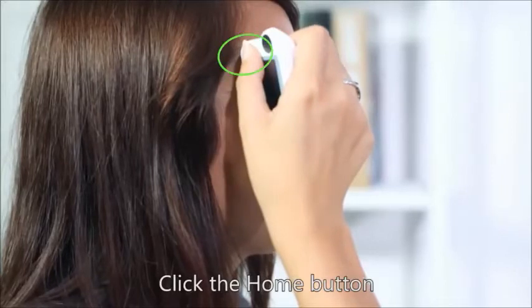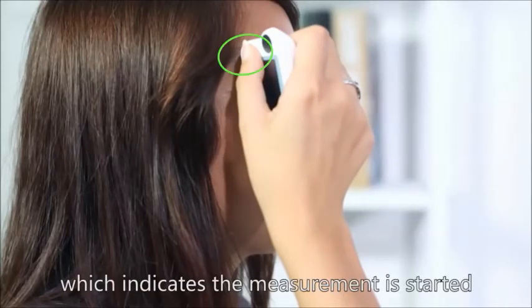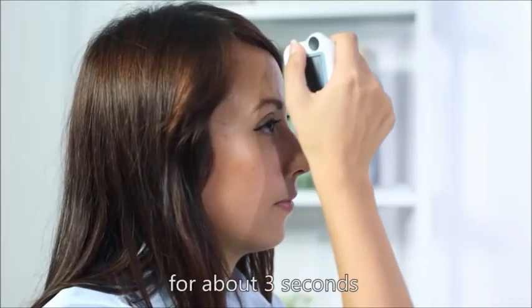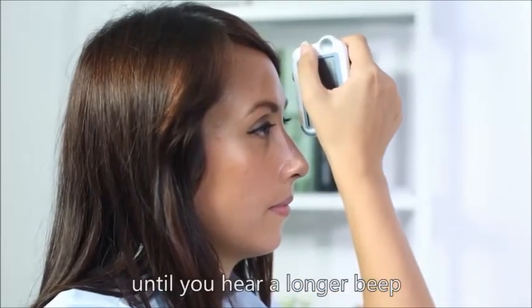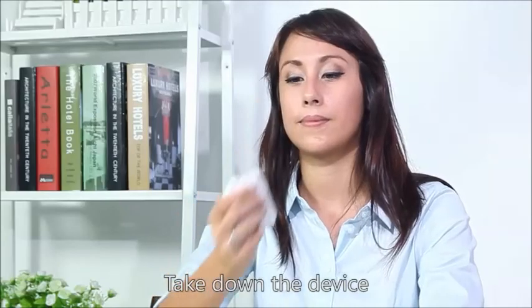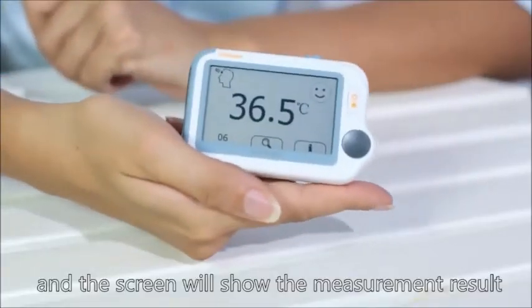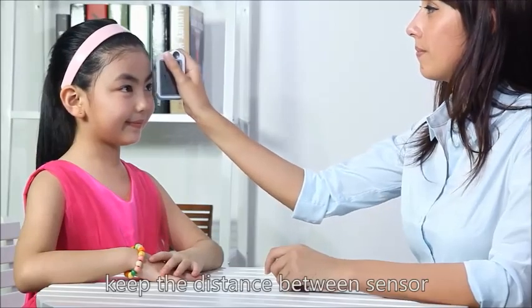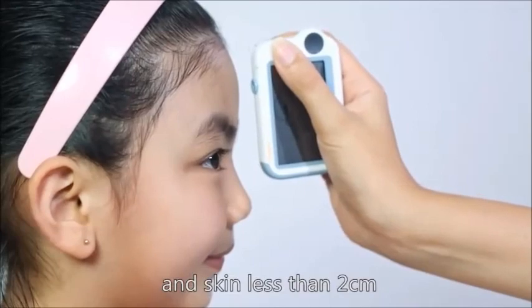Click the Home button. You will hear beeps, which indicates the measurement is started. Move the device to the forehead for about 3 seconds until you hear a longer beep, which indicates the measurement is finished. Take down the device and the screen will show the measurement result. During testing, keep the distance between sensors and the skin less than 2 centimeters.